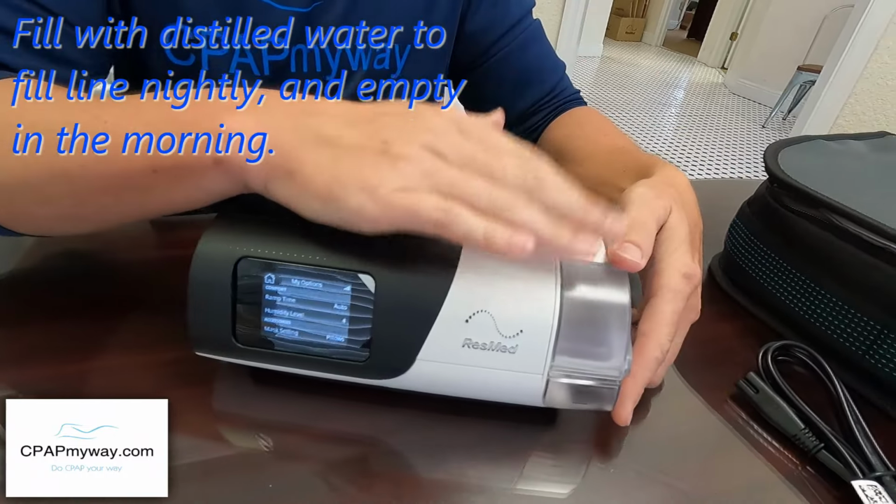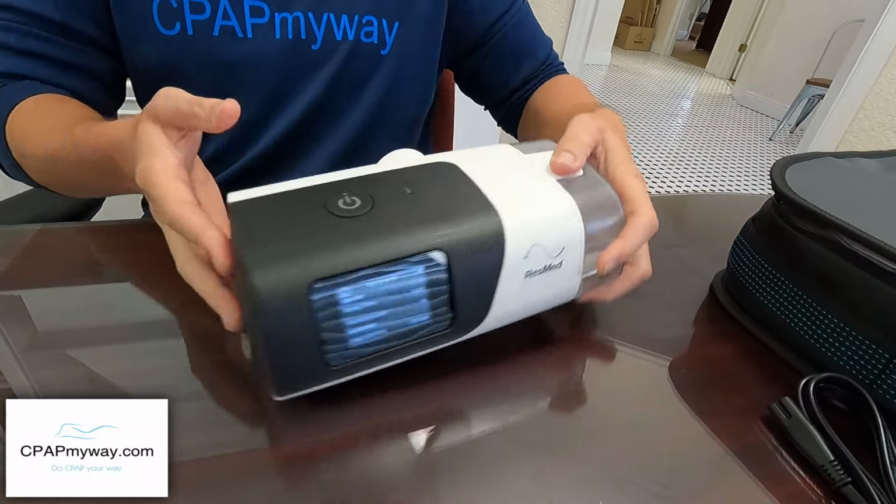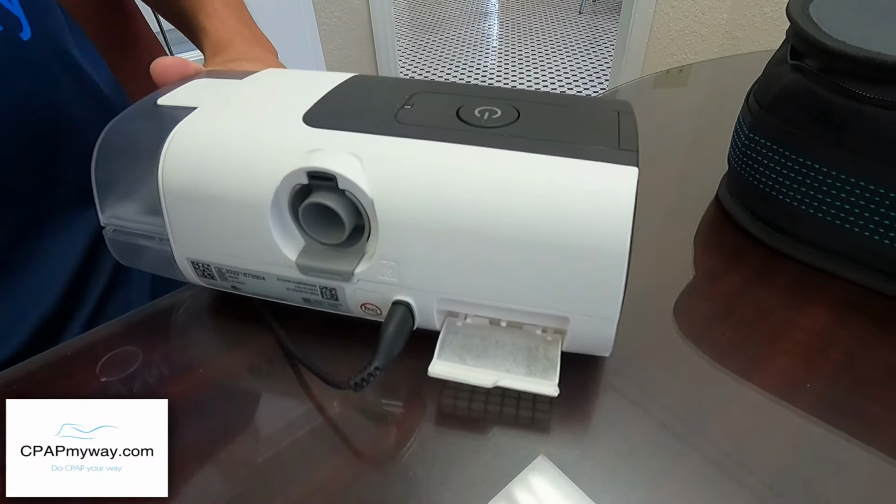The humidifier chamber is obviously over here on the right side of the machine. It slides in and out like a tray. And then your filter is on the back under a little flap right here. I'm going to talk a little bit more about that.